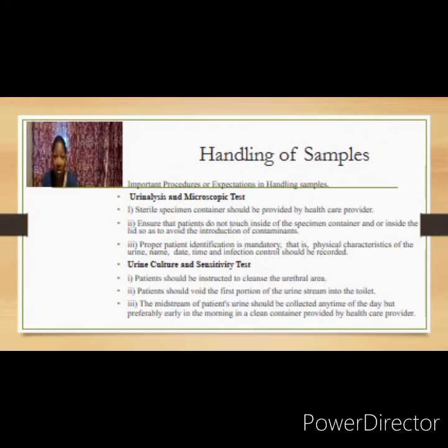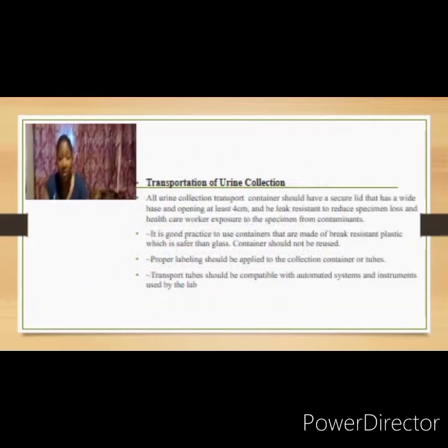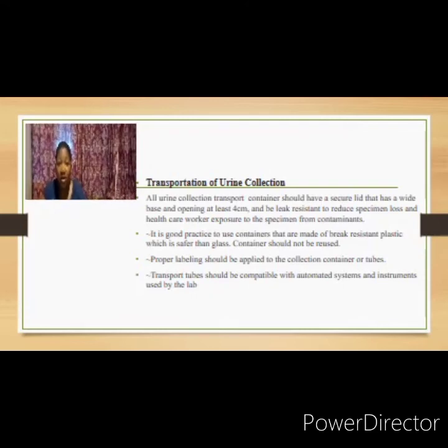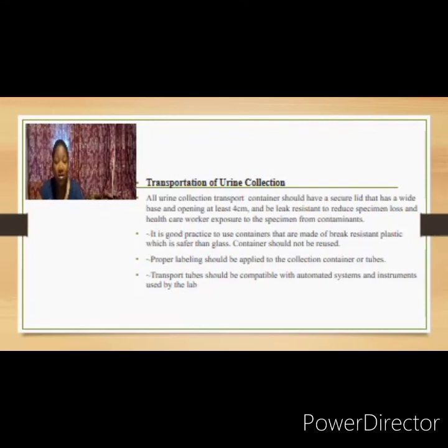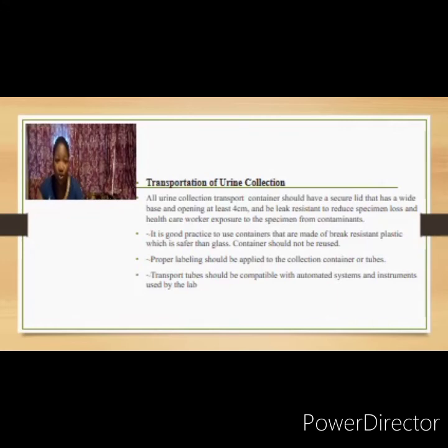When urinating in the container, avoid touching the inside of the container and also catch the midstream of the urine. When taking the urine specimen to the healthcare provider, it should be covered in order to prevent spillage or contact with any other person or the healthcare provider. Unless otherwise notified, it should be refrigerated and you'll be instructed as such.